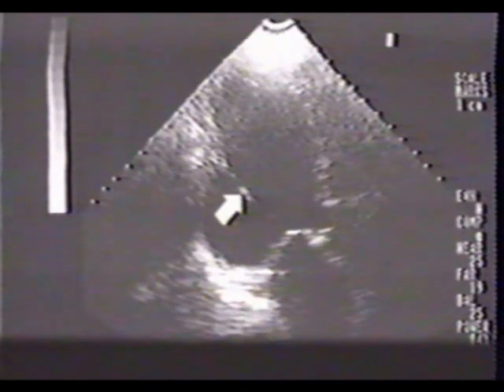Such patients usually have associated significant mitral regurgitation. Furthermore, if a decision is made to resect these aneurysms, the surgical procedure will usually have to involve mitral valve replacement as well. Note the severe reduction in LV systolic function.